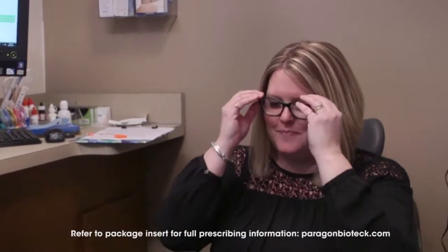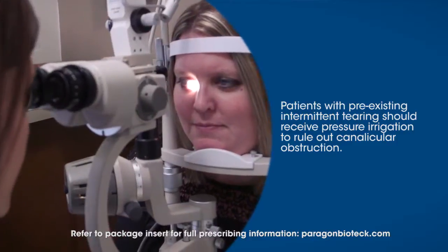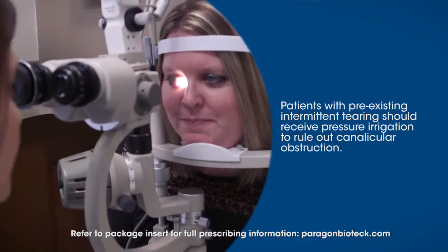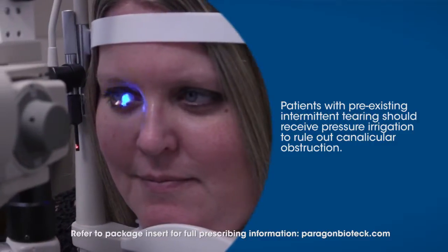After bringing the patient back to the exam lane, be sure that you perform a thorough exam and a complete history before you decide whether punctum plugs are needed, and also before you decide what type of punctum plug you're going to insert.